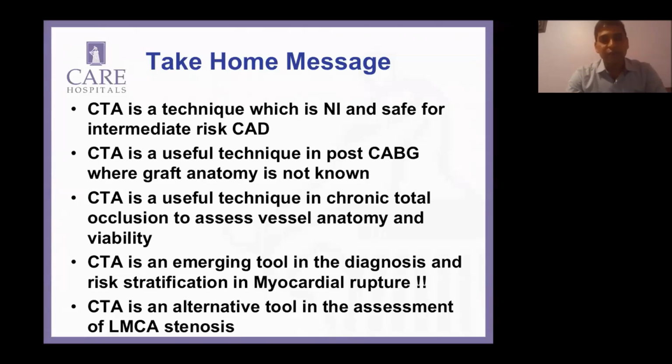So here I have two questions. One is, when we do a CT scan, is it enough to get a plain CT and know the calcium score, or do we need to go ahead and do a coronary angiogram in total? Second question is, what are the implications of having a calcium score of 0 or higher? If it is 0, can we just leave the patient and say that your total risk is almost nil, or the atherosclerotic burden is almost nil?